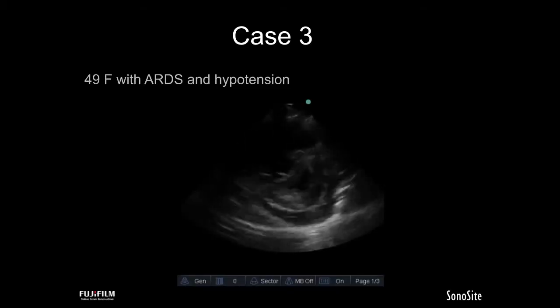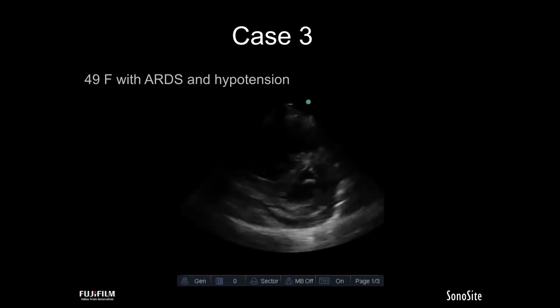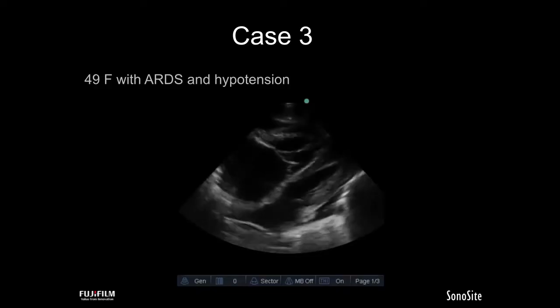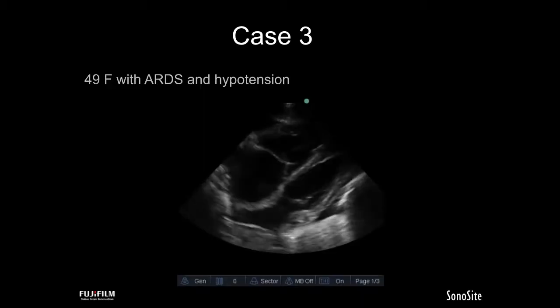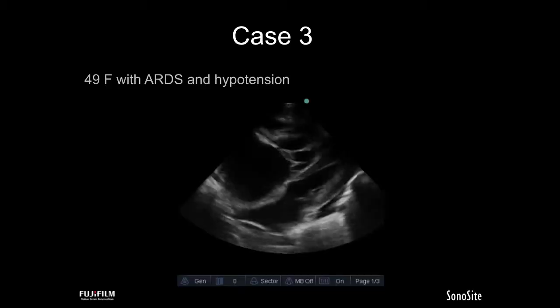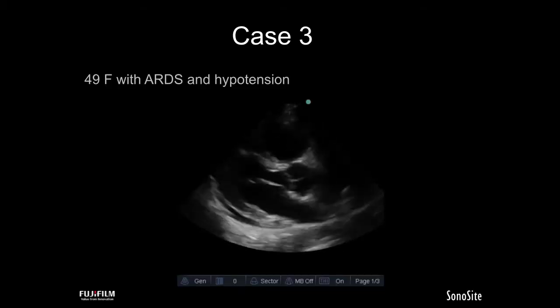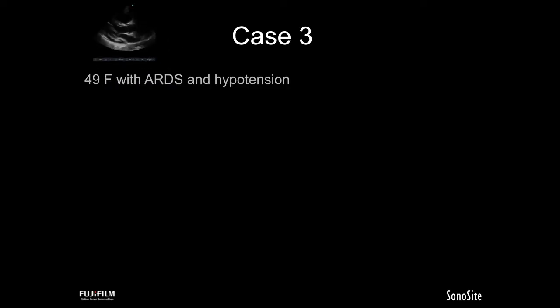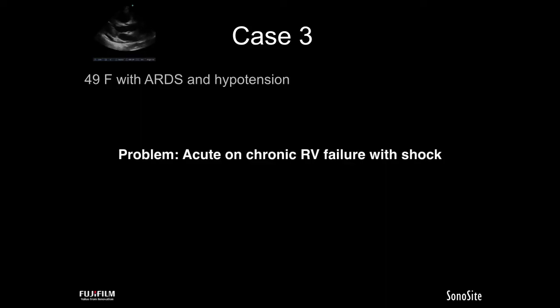This is really highlighted here on the short axis where you've got a D-shaped left ventricle, and the RV is large with that pericardial effusion again. The subcostal view again highlights now the first side-by-side chamber comparison. The RV is much larger than the LV. No big surprise there. You've got right atrial enlargement, which is massive, and the effusion is, again, well seen. So, does this tell us how to manage this complex patient? Well, not overly well. And really the concern here now is you've got previous pulmonary hypertension.